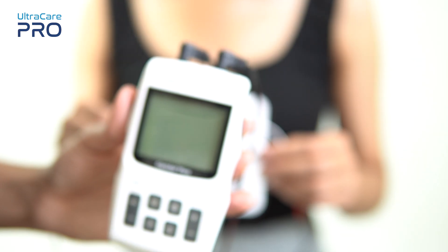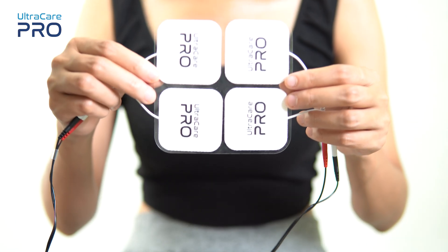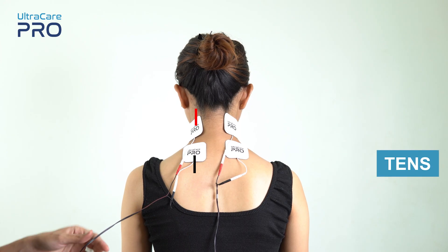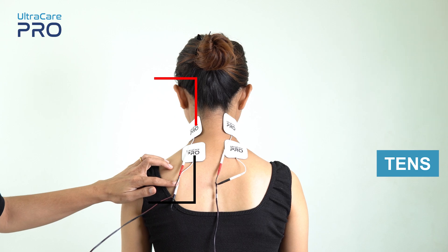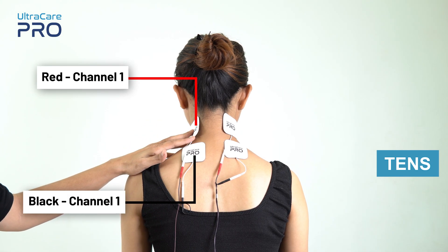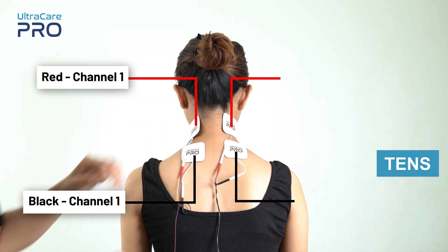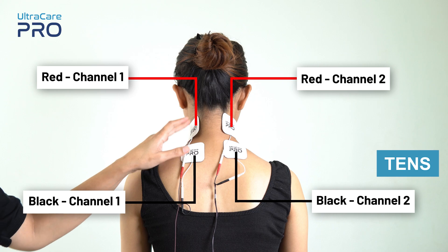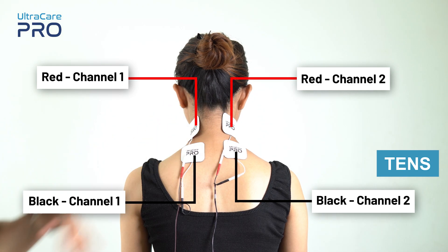Each channel supplies current to two electrodes — one red and one black. For TENS application, place the red and black electrode from channel 1 on one side of the neck. Similarly, place the red and black electrode from channel 2 on the other side of the neck region, in a way that the electrodes cover the entire painful area.